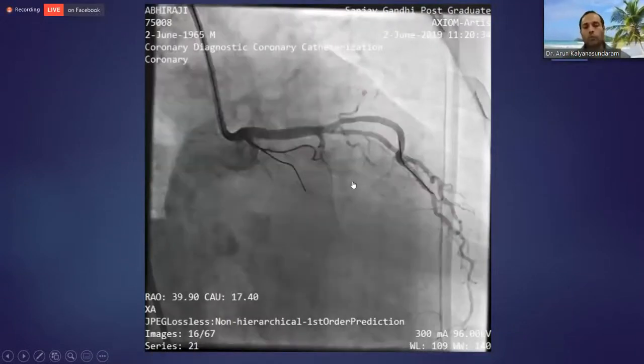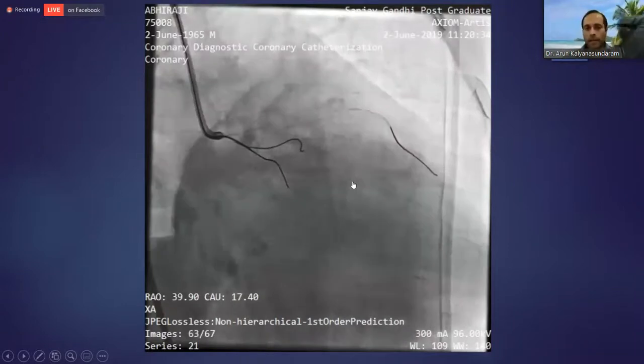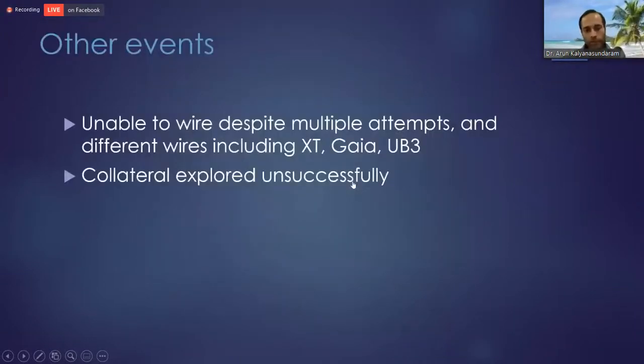Tried wire for a while. And again, we're two experts, two different philosophies, but unfortunately couldn't really wire this. Although between the two of us, we've done a ton of CTOs. But again, not every CTO can be wired. That's really the message that I want to get across.